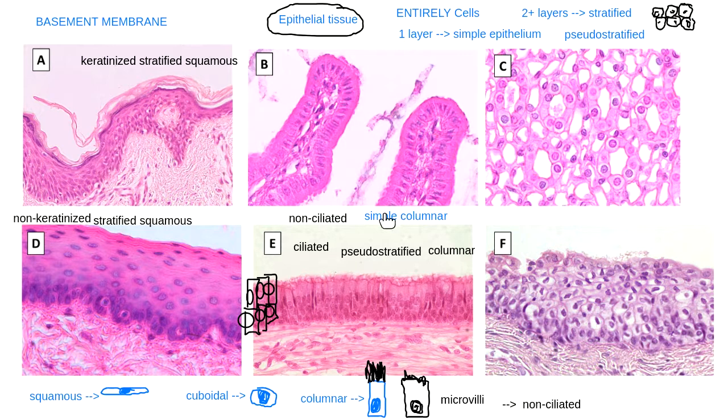When I come over here and look at this tissue image, you have to get a little bit of practice looking at this type of tissue to know how to interpret this image. The type of tissue we're looking at occurs in these little rings that we can see right here. And that is a hallmark. Every time I look at this type of tissue in our lab class, you're always going to see these little circles of cells.